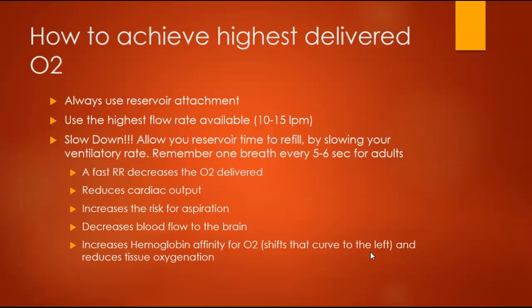Usually when we're in this situation where we're manually ventilating a patient, there is a lot going on. There's a lot of energy in the room. You will certainly feed off of that energy, and you can end up hyperventilating your patient very easily without even paying attention. It's very hard to focus in code situations. We get distracted by other things that are going on, and then all of a sudden you'll realize you're just cooking away, squeezing that bag at 20, 30 times a minute.